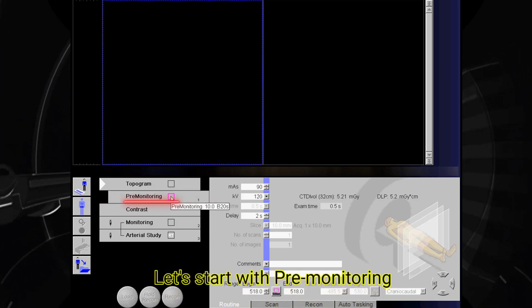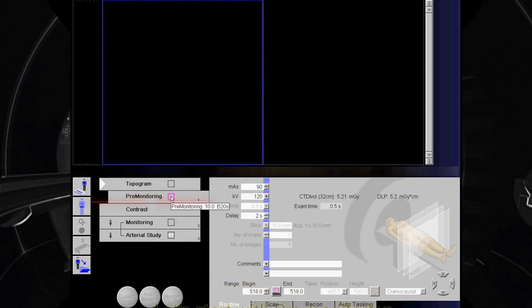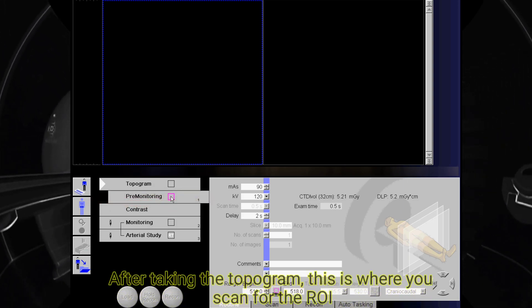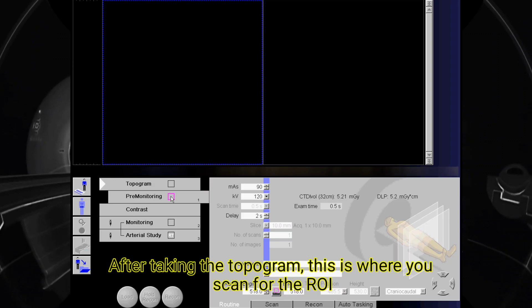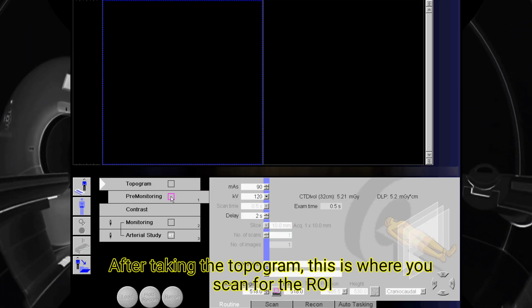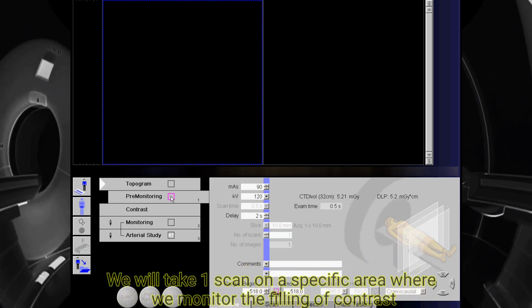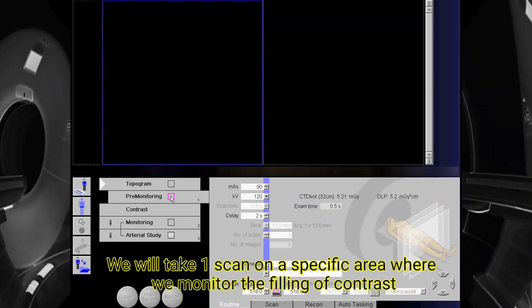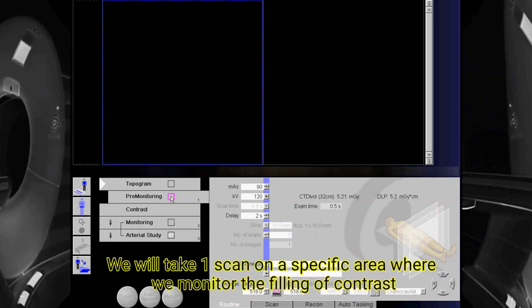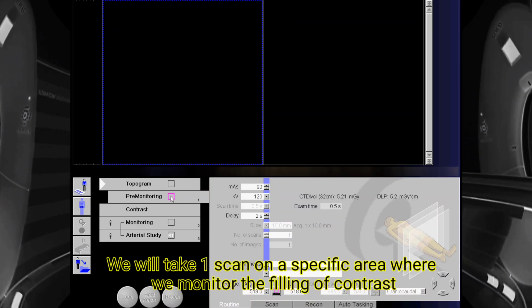Let's start with pre-monitoring. After taking the topogram, this is where you scan for the ROI. We will take one scan on a specific area where we monitor the filling of contrast.